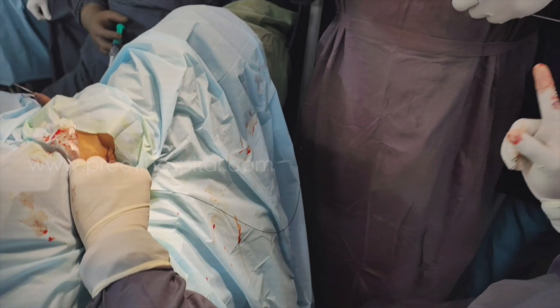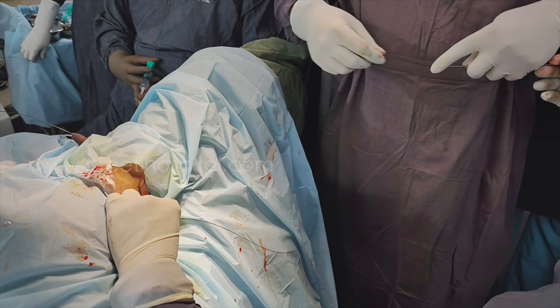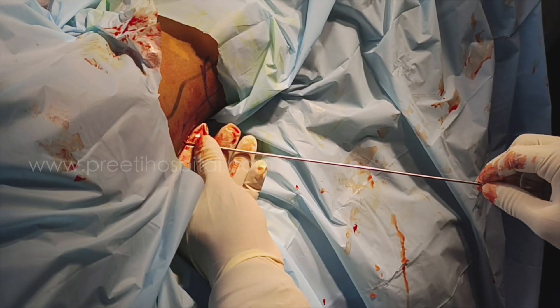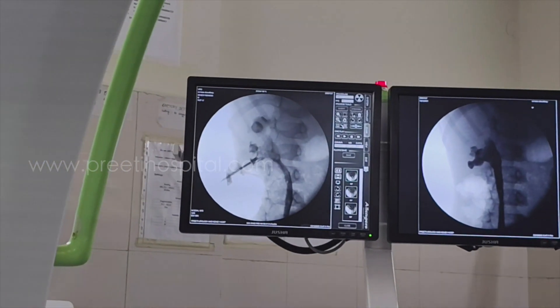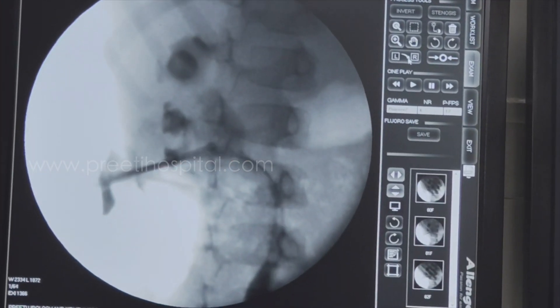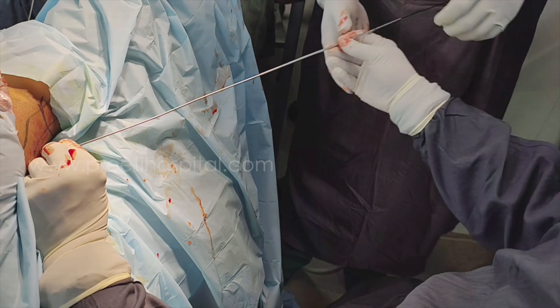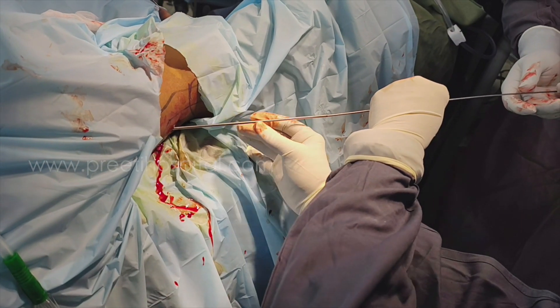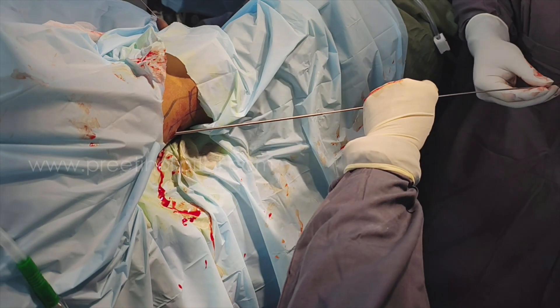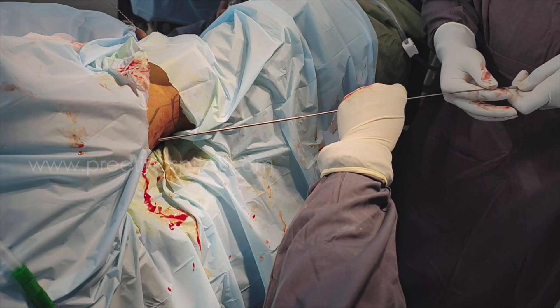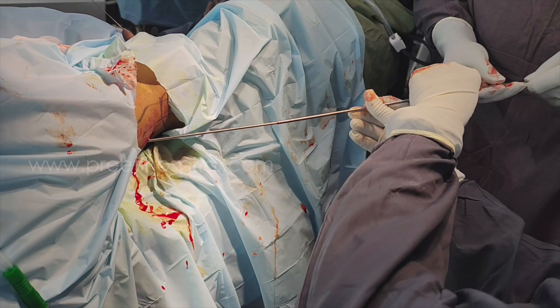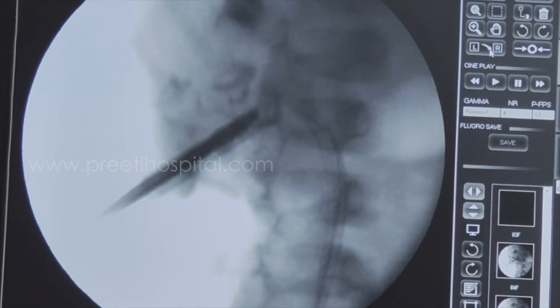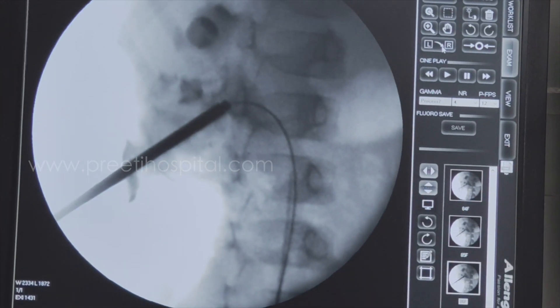Always tilt like this — don't do dilatation straight down, that is dangerous. Now go slowly in this direction. Don't go down. This is my favorite point — go up towards the upper part of the calyx. Why? Because the longest mucosal path is available. If at all any damage is to be done, it will be minimal. But if you take the shortest path, it is dangerous. Now keep infusing saline when entering.